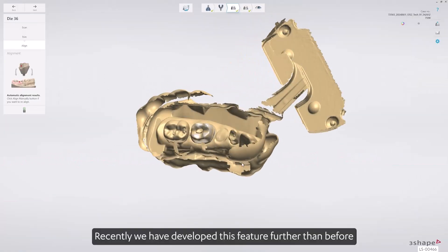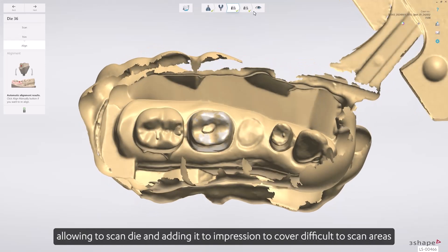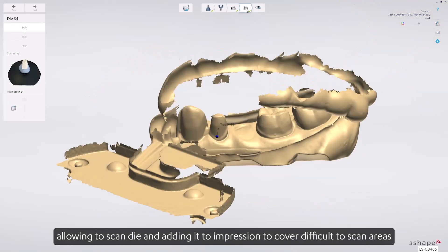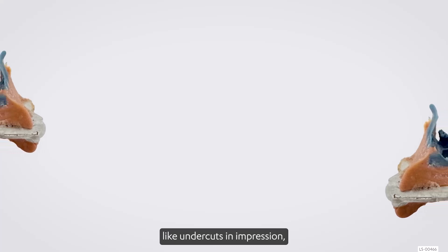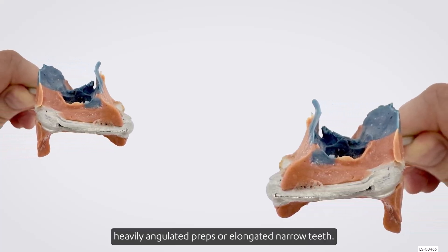Recently we have developed this feature further, allowing scanning of die and adding it to the impression to cover difficult-to-scan areas like undercuts in impression, heavily angulated preps, or elongated narrow teeth.